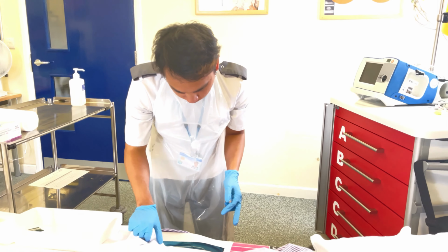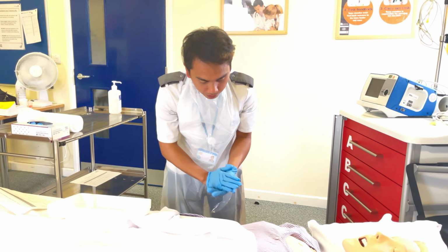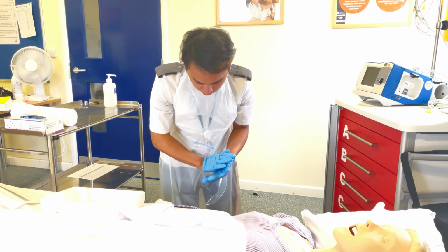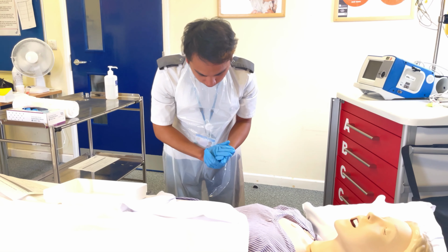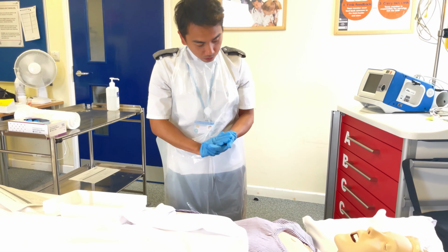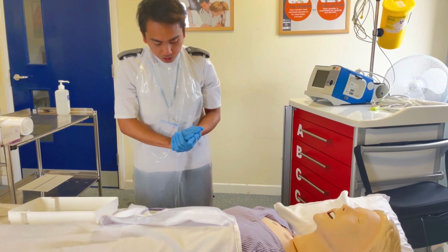All right, Hausa, I can see that at the site there's slight redness. Do you feel any pain? Yes, it's painful. Okay, I can't see any swelling at the site. So I can see that the site has redness as well as pain, so I would score it as 2. That just means, Hausa, that it's at the early stage of phlebitis.